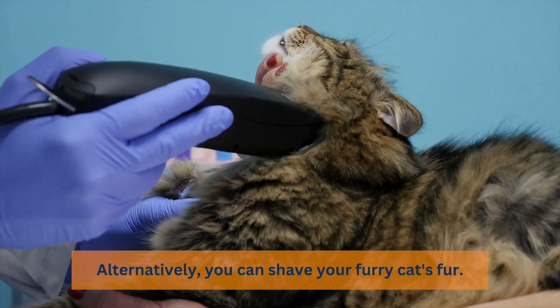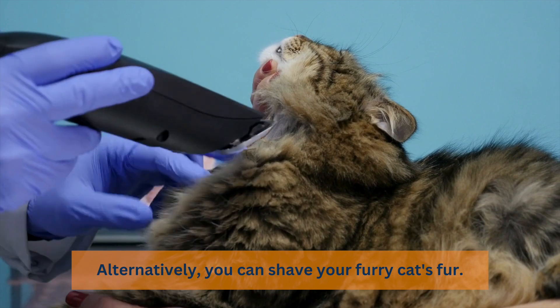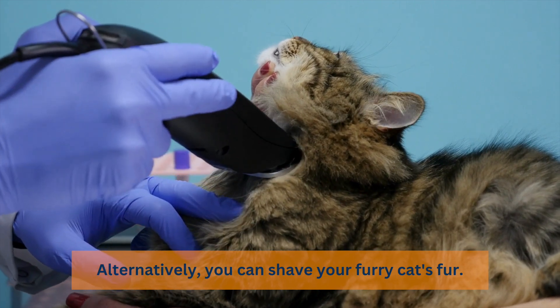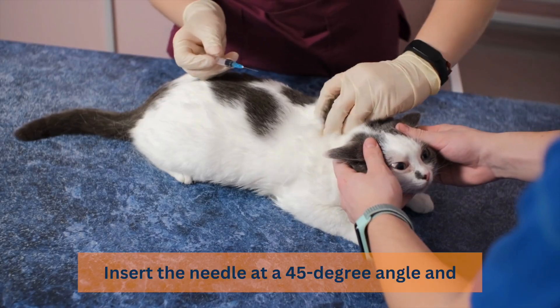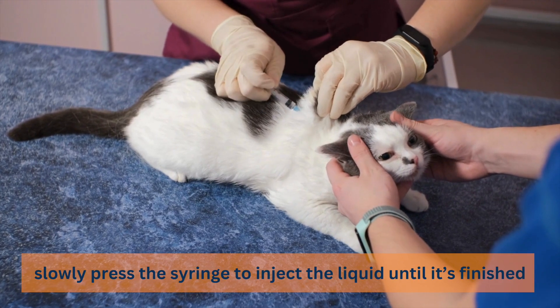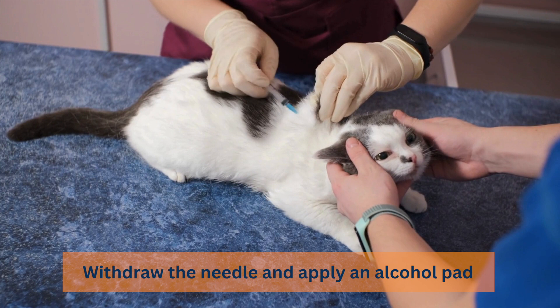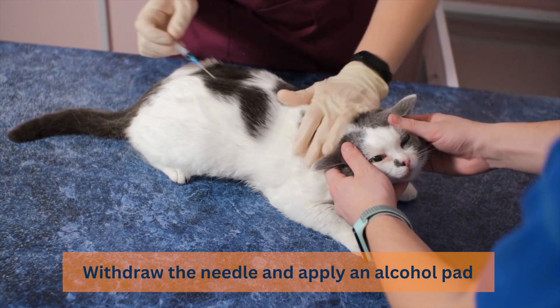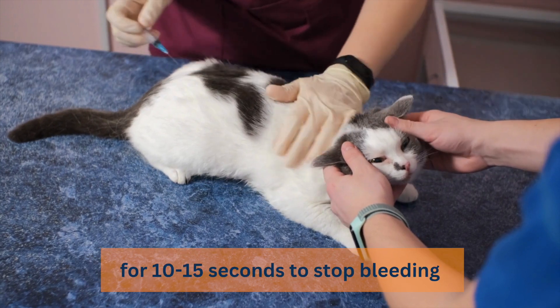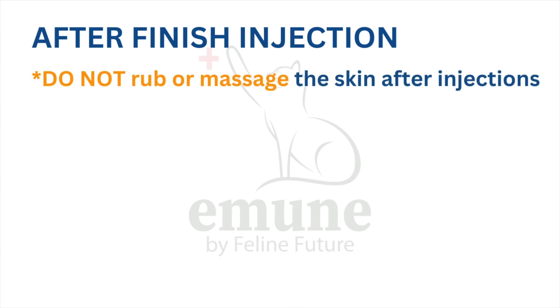Alternatively, you can shave your cat's fur. Insert the needle at a 45-degree angle and slowly press the syringe to inject the liquid until it is finished.